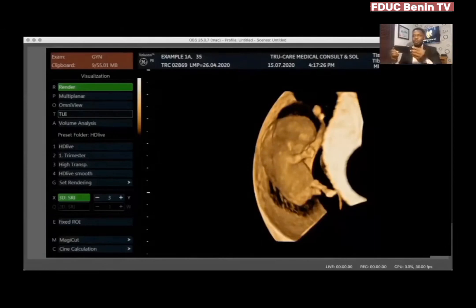Now, I'm holding a phone in my hand, and this phone is quite horizontal. If you remember how we plotted the graph, you have the x-axis and the y-axis. So when we manipulate our image, if we do any manipulation along the x-axis, what it's going to mean is that we're rotating this image along this x-axis this way.